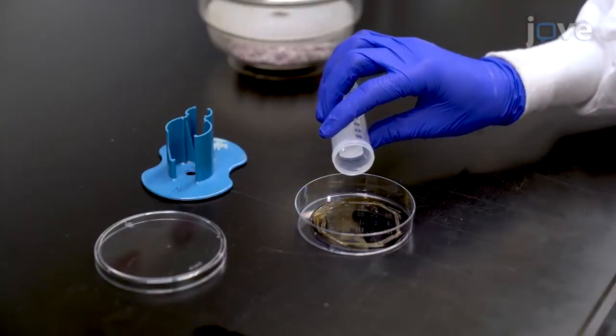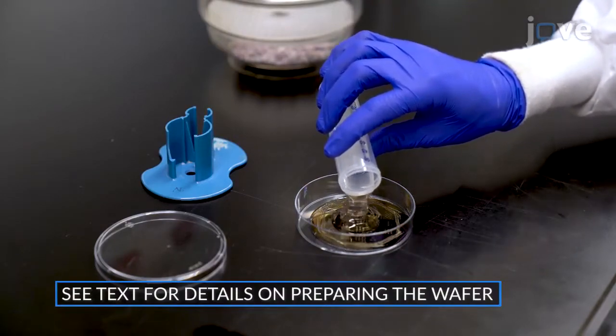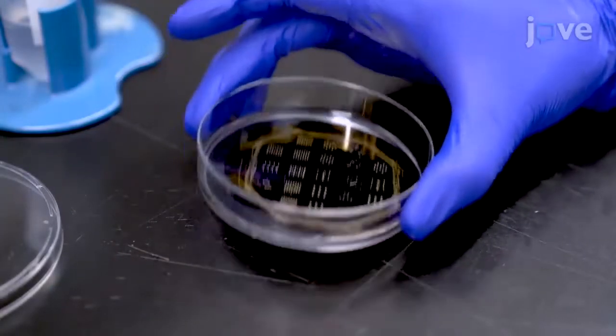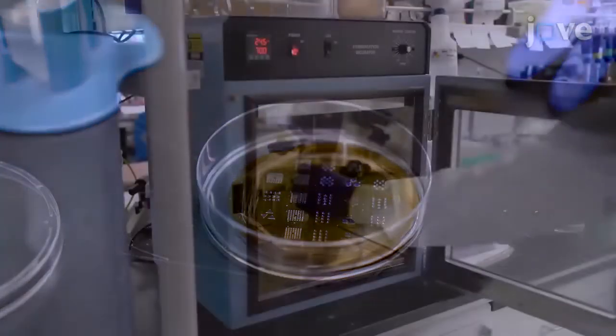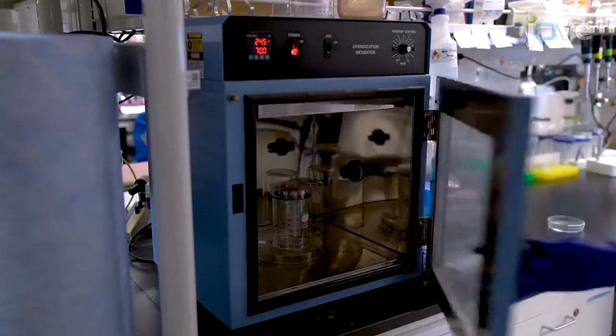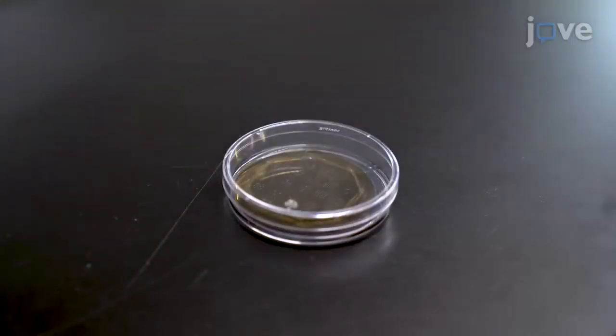Slowly and evenly pour the PDMS mixture over the surface of the prepared wafer. Tap the dish on the work surface to release any air bubbles from the surface of the wafer. Bake the PDMS at 70 degrees Celsius for 2 hours and allow it to cool to room temperature.